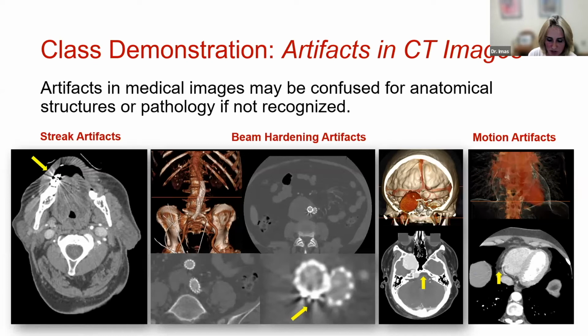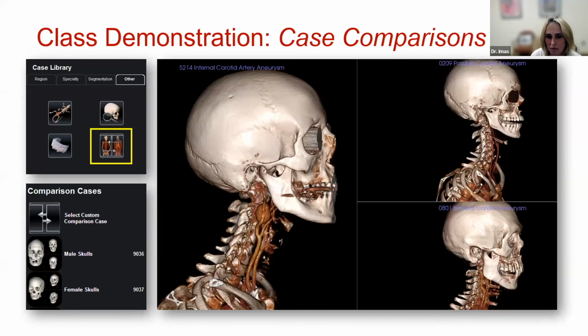Really briefly, I really like this feature. I know I'm probably over time. It's the case comparison feature. It's under the case library, under the tab Other, and it's highlighted in yellow in this laptop image example. It allows you to compare up to three cases at the same time.